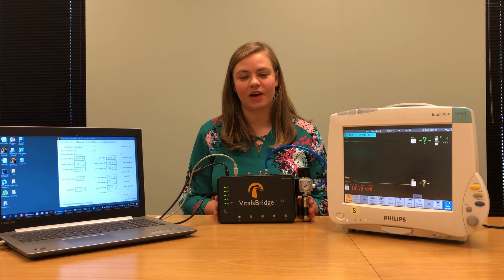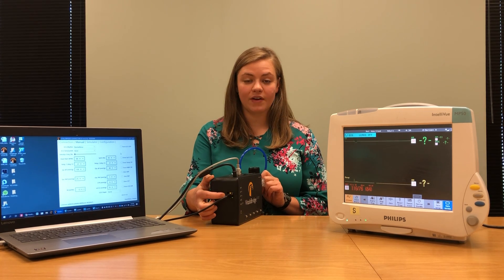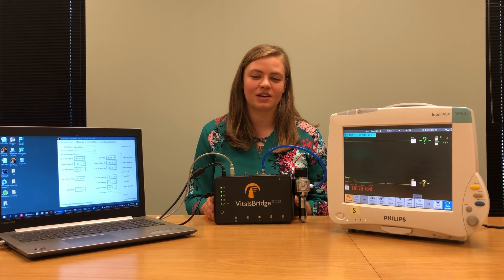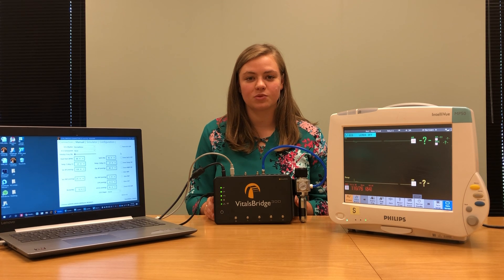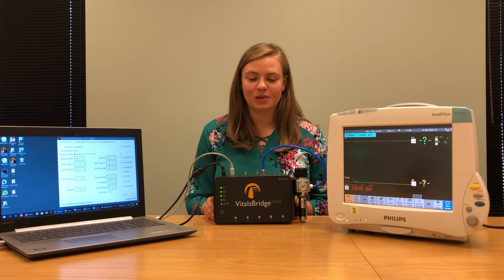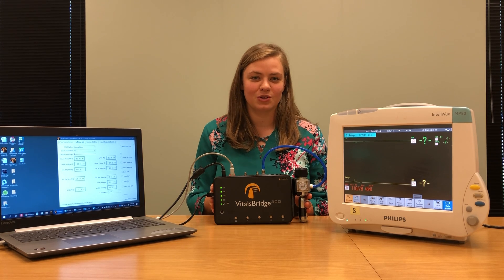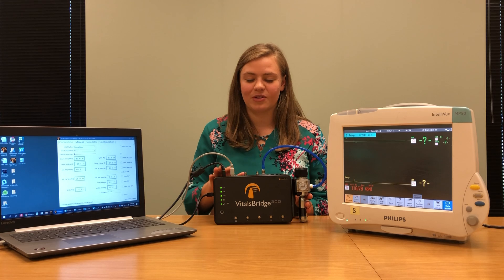You can also connect your VitalsBridge 300 to a computer using an Ethernet cable or Bluetooth. Ethernet cables are plugged in here on the VitalsBridge and into the computer, and Bluetooth is configured the same way you would configure any Bluetooth device. The VitalsBridge 300 can also be controlled from the VitalsBridge connector app on any Android mobile device or tablet. The app can be downloaded from the Google Play Store.